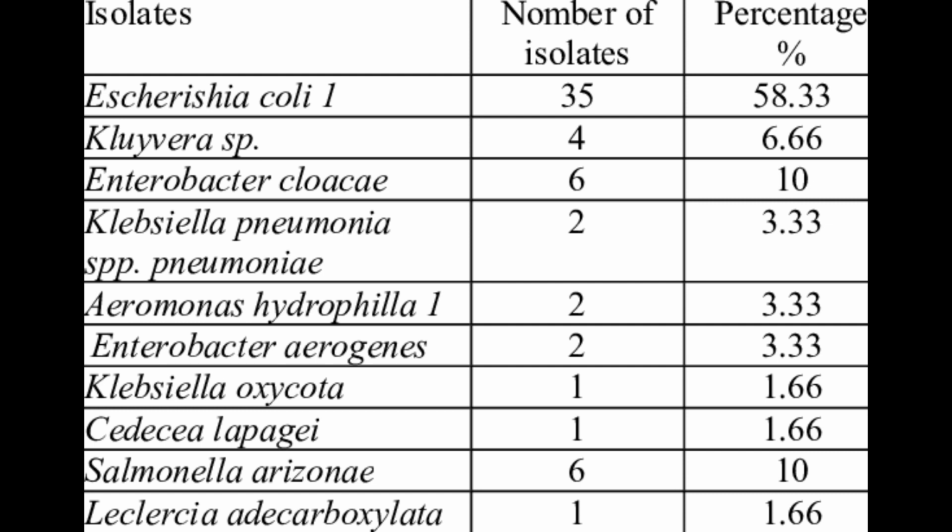So let's move on. We have ornithine decarboxylation, where the medium is MIO, which tests motility, indole, and ornithine. It is a semi-solid medium with glucose, ornithine, and bromcresol purple. There are deep butt tubes. Their positive is purple butt, from putrescine, with a slight yellow tinge, and their negative is bright yellow butt with purple rim. Their motile is hazy medium, and their non-motile is clear medium with growth in the stab line.